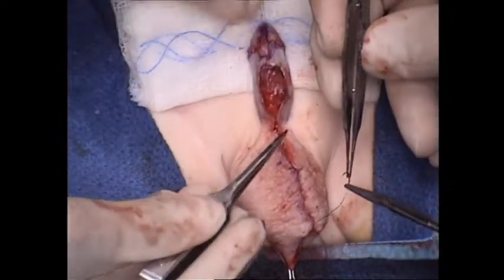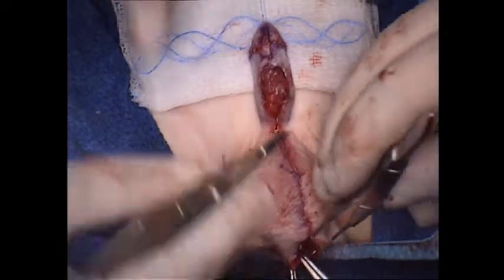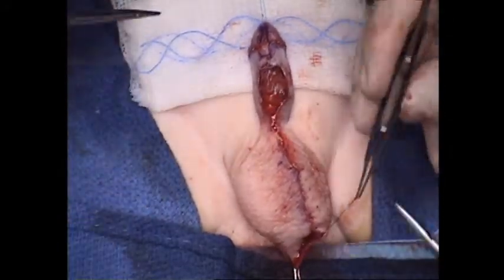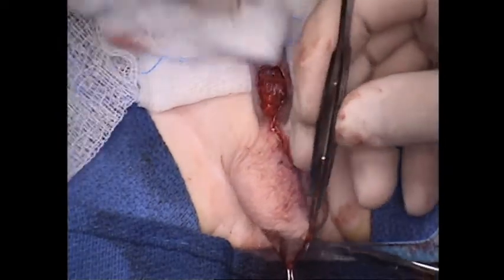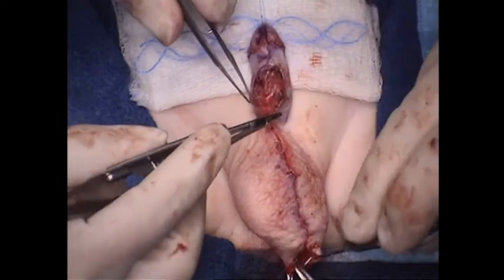But now that we've got the graft all harvested, we can go ahead and start this reconstruction as well, so that again, at the very end, all we have to do is put our graft in. But everything else is all set and ready to go. So again, the order in which steps are done also makes a big difference in this operation.